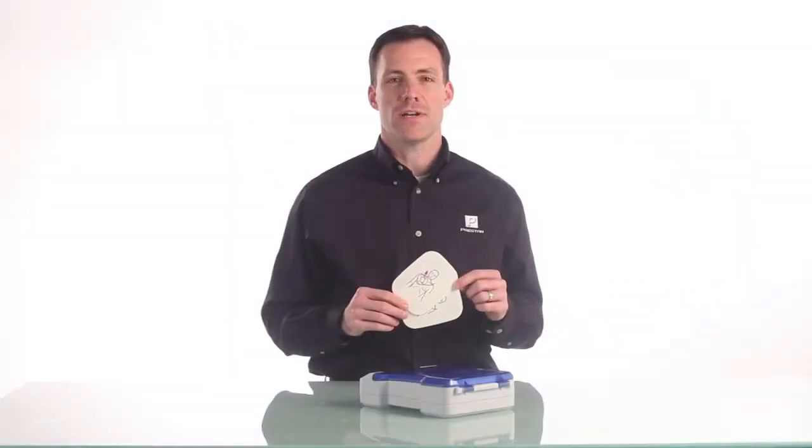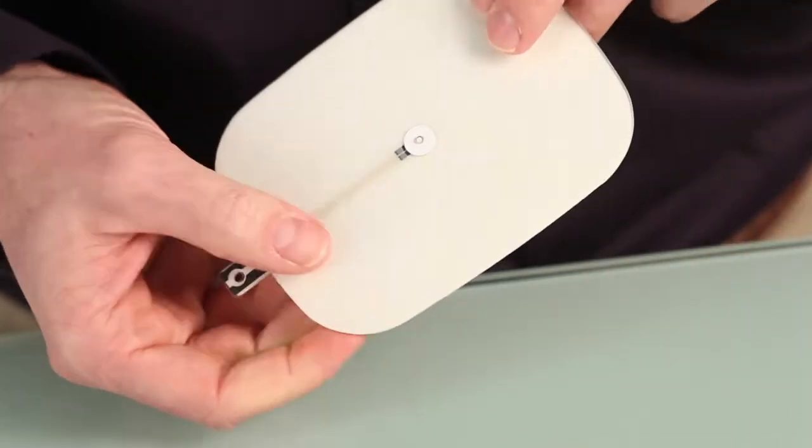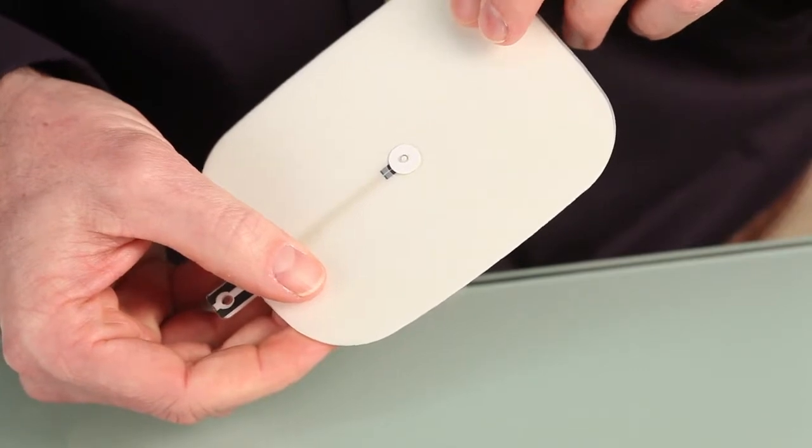The Preston AED Trainer pads are made of a durable foam-like material with a silicone-based adhesive, providing a minimum of 25 to 30 applications.